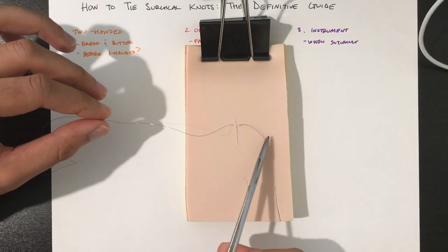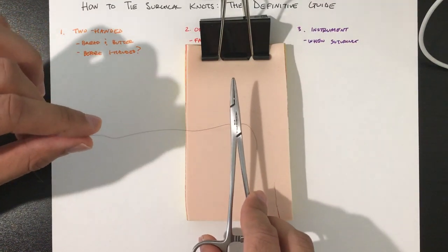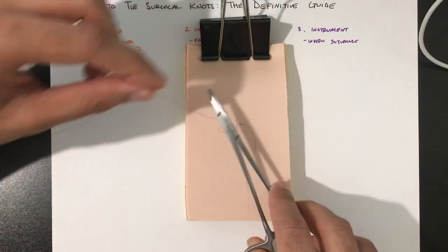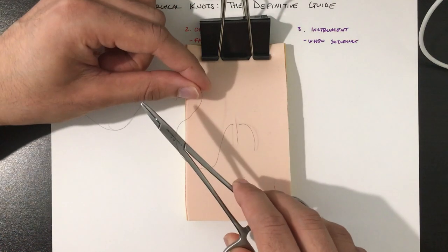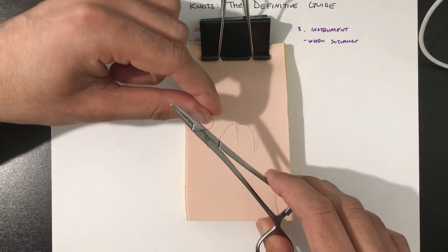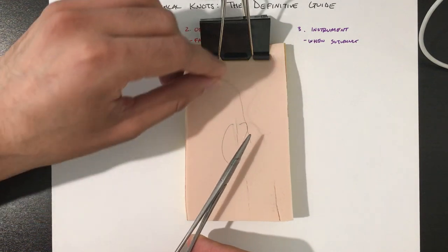To do the instrument tie, lay your needle driver in the center between both, then wrap the suture from outside in, like so. If we're doing a surgeon's knot, we would do it twice for the first one. Grab the short end and pull.